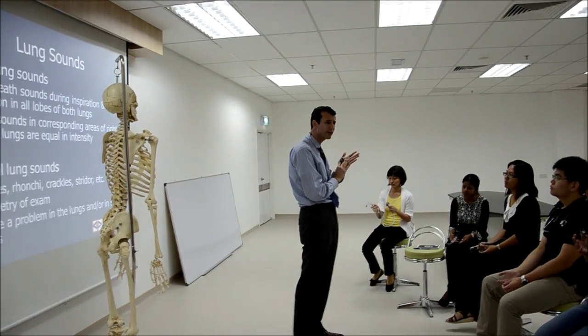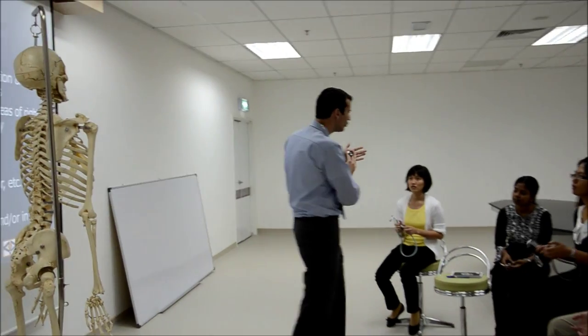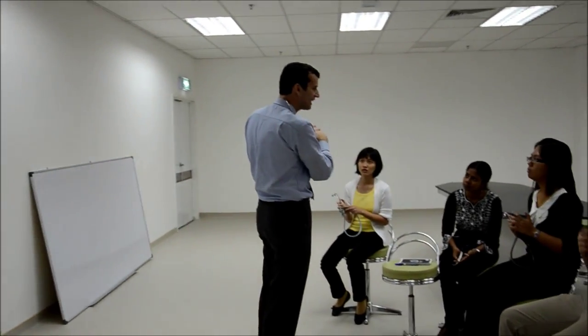Press pretty hard. You actually should press hard. You should usually press hard enough to leave a little indentation. Yeah, so you shouldn't press so lightly. You should actually press hard enough to leave a little indentation.